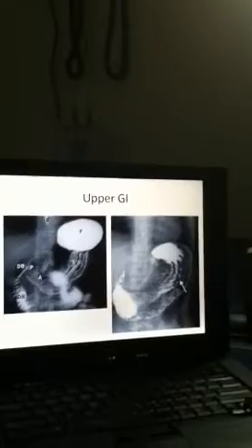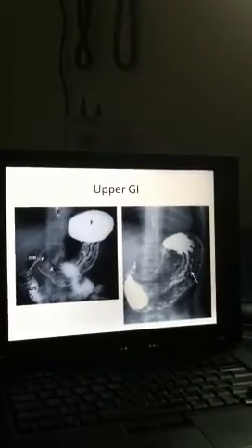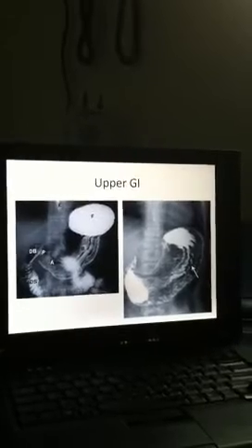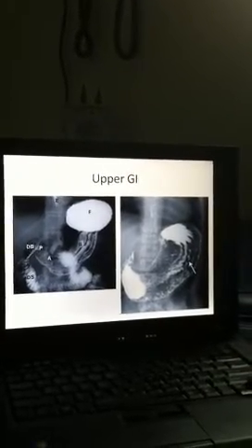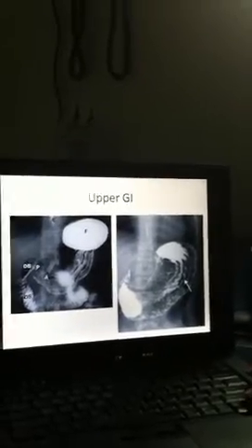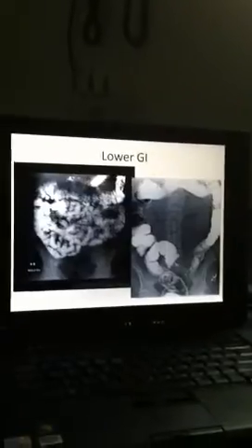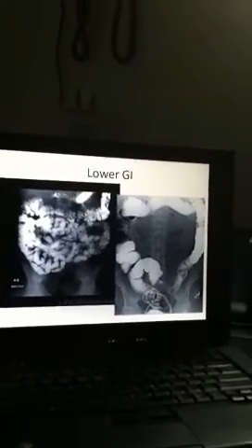Does the barium get up to the fundus? I thought that it always stays. Well, you move the patient around to try to, the patient's lying down, you move them around, like you'll see them doing a lot. They'll lay on their side, just try to get the dye to cover everything. Okay. That makes more sense. It's not fun for the patients.